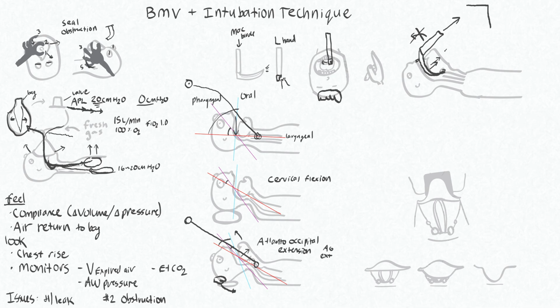So after you've pulled on the laryngoscope, hopefully this is all displaced and you'll get a good line of sight. And so what you'll actually be looking at here is your glottic view, which I've drawn for you here. And the ease with which you can see these glottic structures is graded on this scale called the Cormack-Lehane grading system. And so this is the best view you'll get. Everything is very clearly visible, and that's your grade 1 view. And I'll label this diagram for you so that you have a frame of reference for what we're looking at.